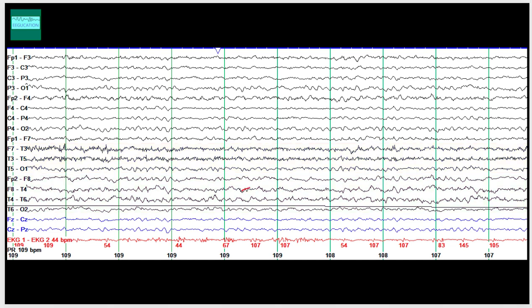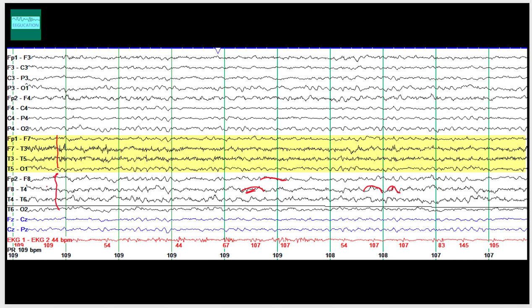Looking carefully, these are the slow waves you're seeing. There are fast waves that lie on top of the slow wave. You're seeing delta activity here, some theta activity right here, and more delta activity. Most of the time you will see a mixture of frequencies — delta underlies, and fast frequencies overlie the slow frequencies. Carefully compare these right-side channels with the first four channels from the left side, and you will be able to appreciate the asymmetry between the two sides.